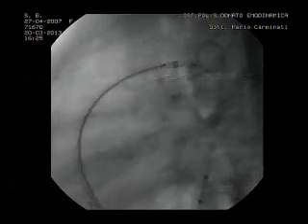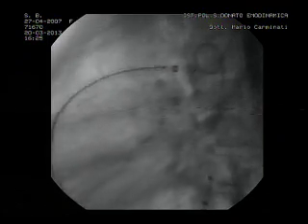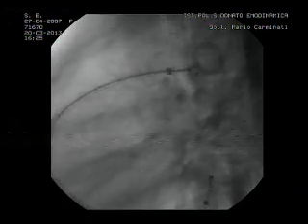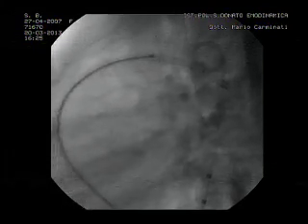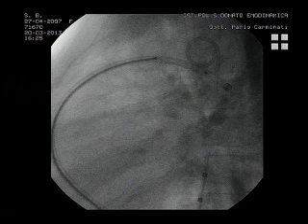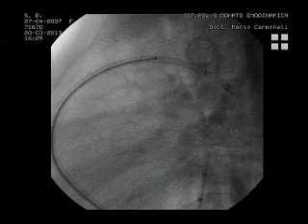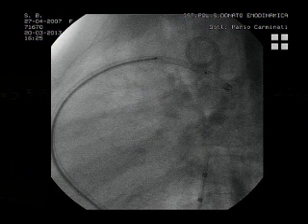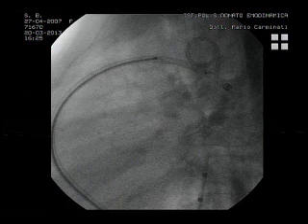Mario, Kevin here. I think you should just take it out and put in an 8.6 or even a 10.8. Well, as you see... It'll take 2 minutes. You would suggest to use a larger device, yes? Yeah, and I think so, because we have two problems here, in my opinion. One is that the length of the ampulla is a bit more than we would like to have. And another point is that the tissue is very distensible, with a stiff wire.